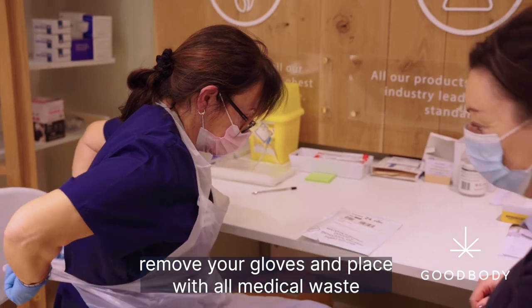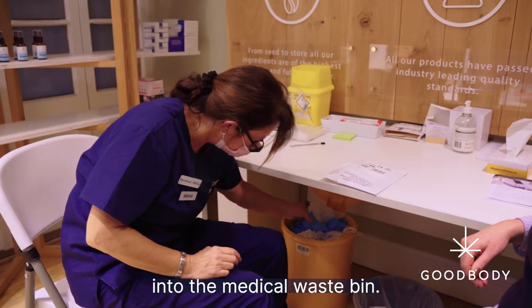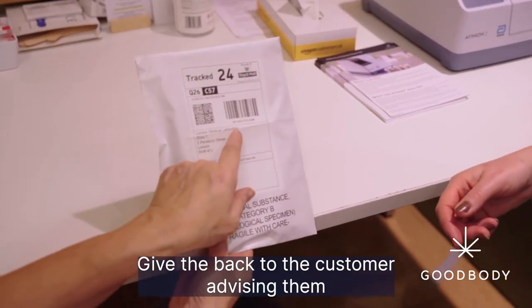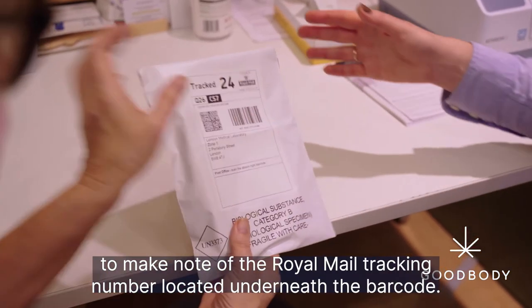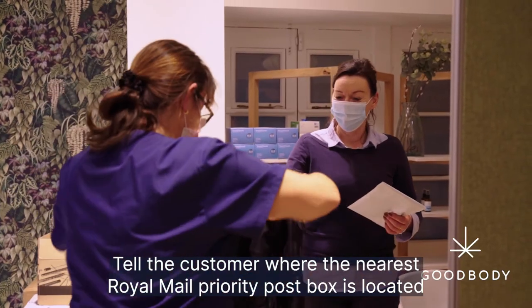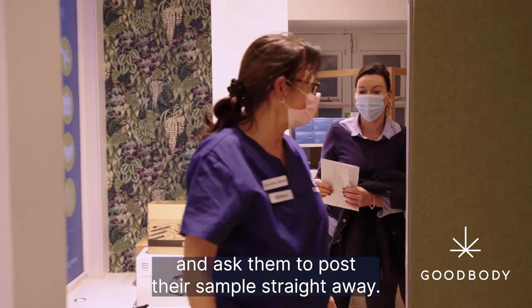Remove your gloves and place with all medical waste into the medical waste bin. Give the bag to the customer, advising them to make a note of the Royal Mail tracking number located underneath the barcode. Tell the customer where the nearest Royal Mail priority post box is located and ask them to post their sample straight away.